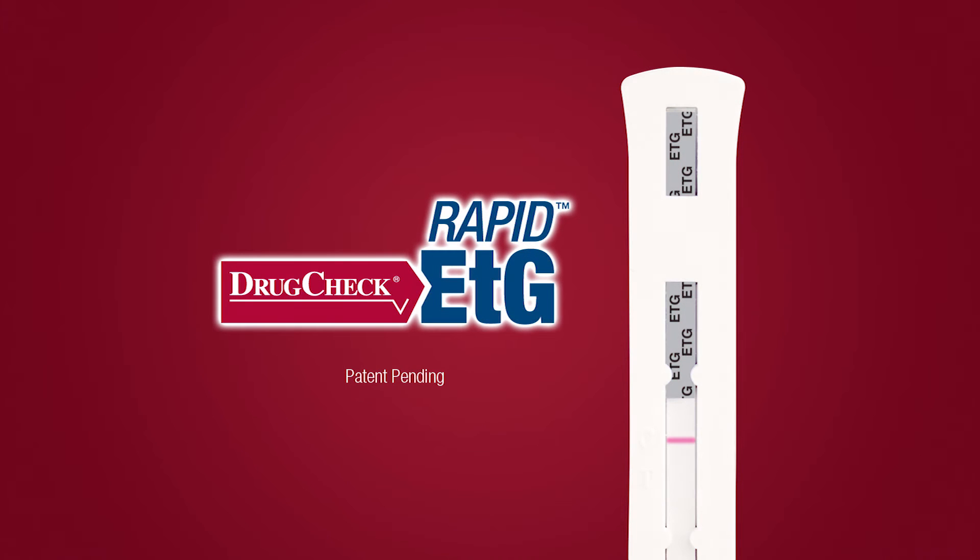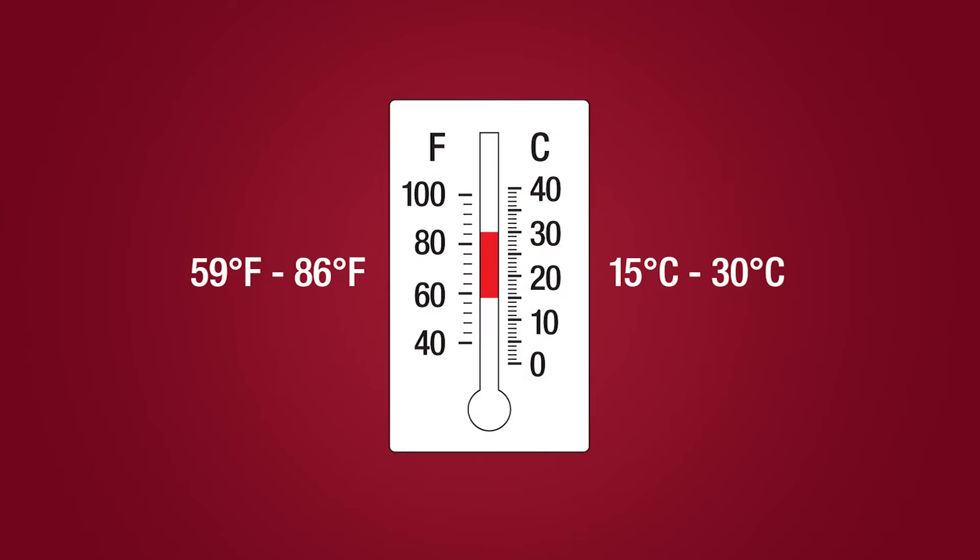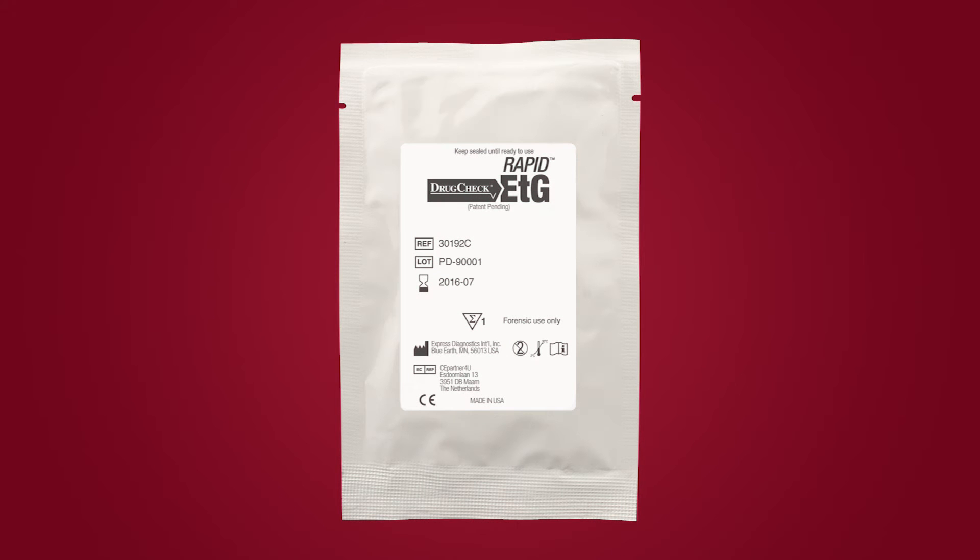Drug Check Rapid ETG Dip Test Procedure. Before use, bring the test device to room temperature, 15 to 30 degrees Celsius or 59 to 86 degrees Fahrenheit. Do not open the test device pouch until you are ready to perform the test.